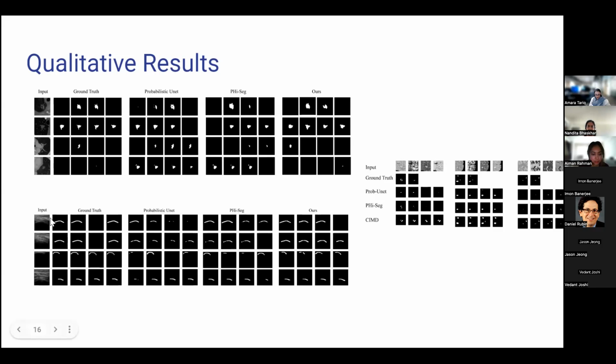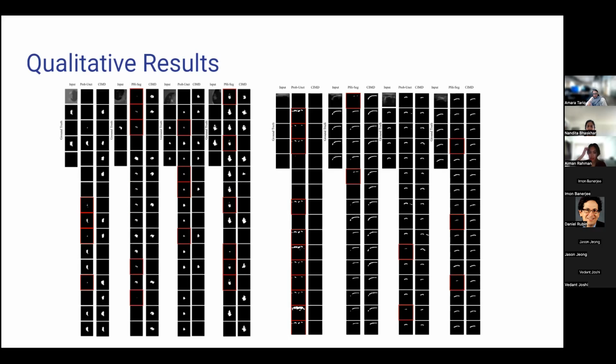These are the results for the ultrasound, and these are the ground truth for the ultrasounds. And these are the MRI results. For MRI as well, it depends on the quality of your latent variable Z, and that also changes. These are some more qualitative examples, where you can see that some of the masks from the CVAE-based method are complete masks, but in some cases you'll get incomplete masks as well.